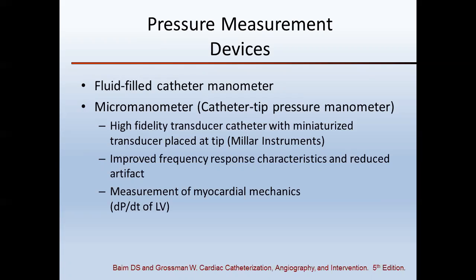A, it's expensive. Each catheter costs like $400 to $600. Number two, it needs a setup to do that, which itself is like $60,000 to $80,000 if you need the complete data flow. So money is a problem.